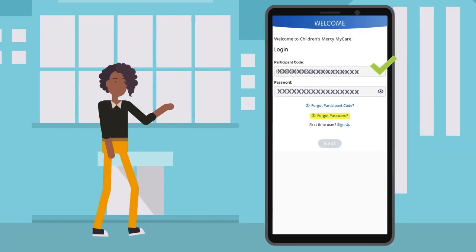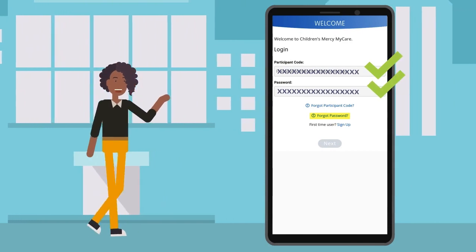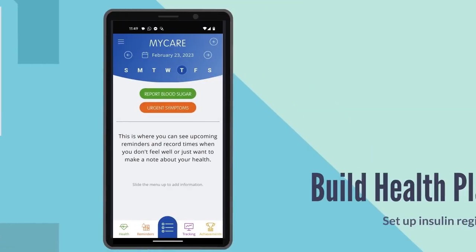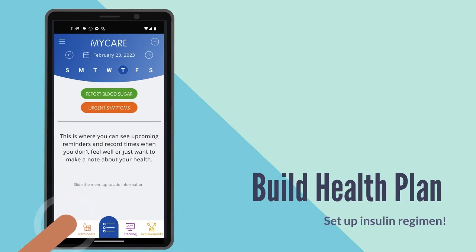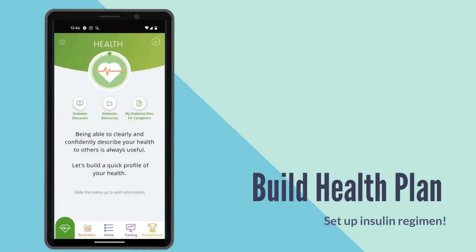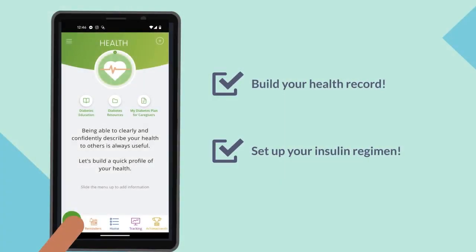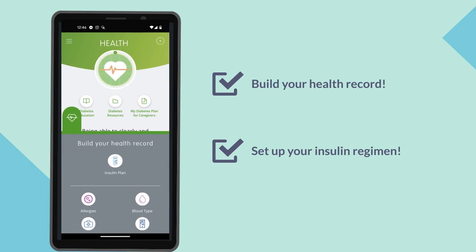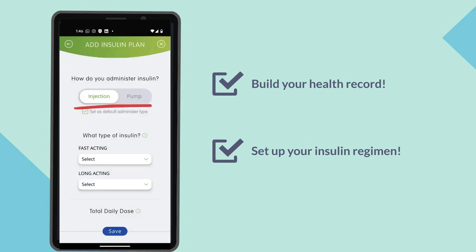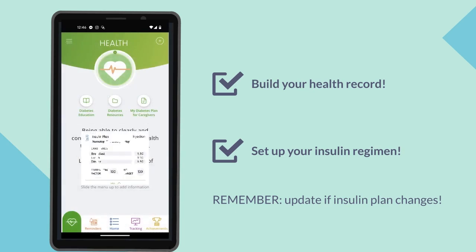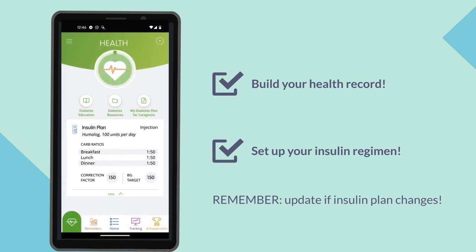Once you've created your ID and password to log in, click on the Health tab to start building your health record. You'll want to set up your insulin regimen first. You will need to choose whether you use an injection or pump so the app will give you correct guidance when entering blood sugars. Don't forget to update if your insulin plan changes. Once completed, your insulin regimen summary will be available on the main health screen.